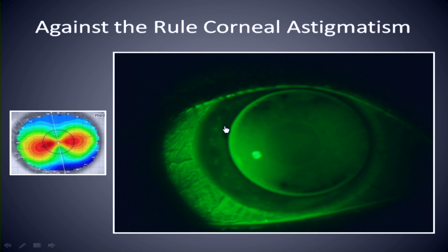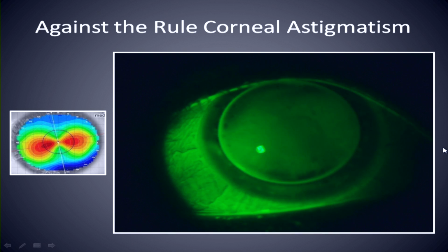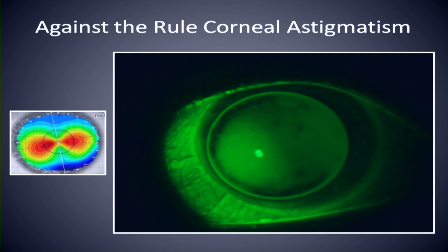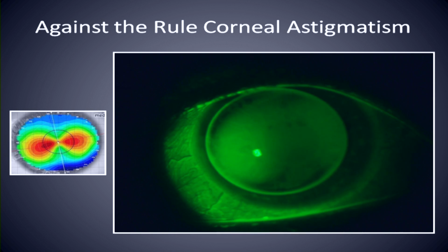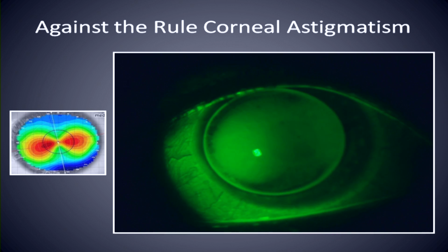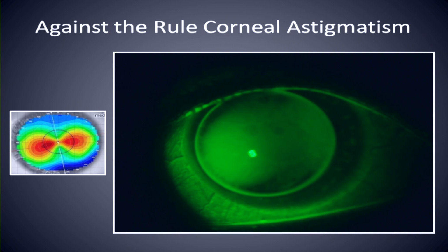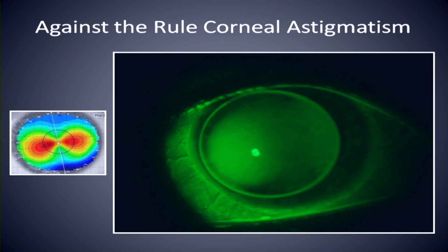Now here's the actual lens that we fit on this patient, and you can see the spherical GP and how poorly this lens is fitting. Have we cleared the corneal apex? Yes, this is good. We're protecting the central epithelium. That's optimal. Our lens is landing at 12 and 6 o'clock. It had to land somewhere.